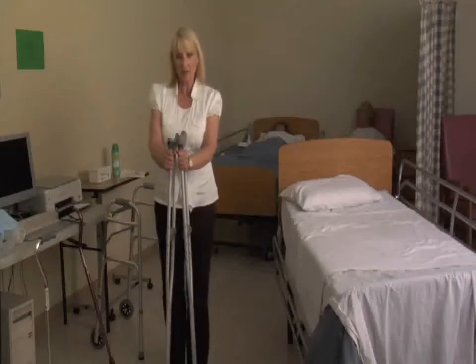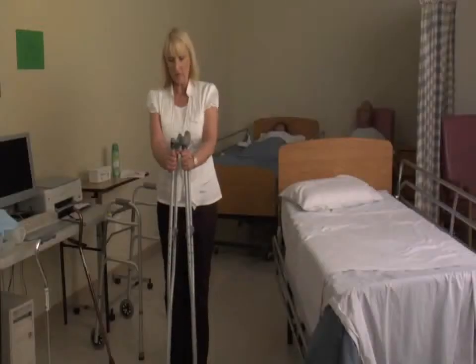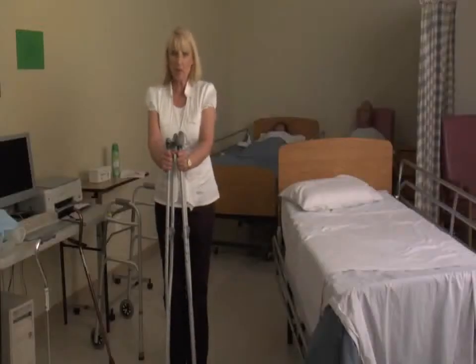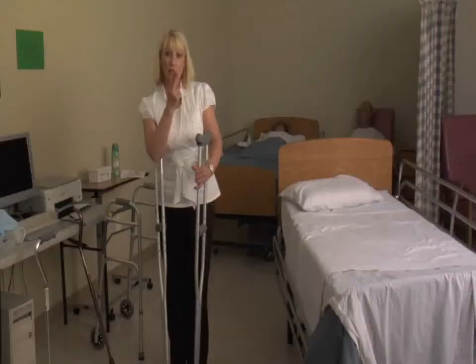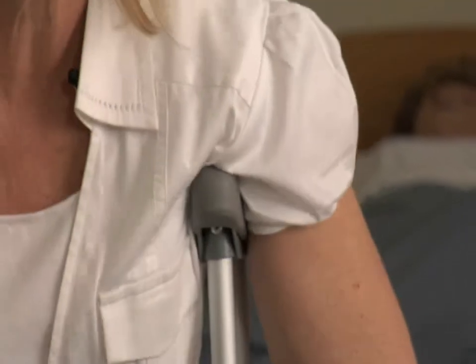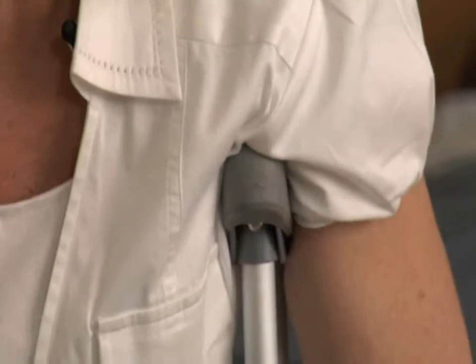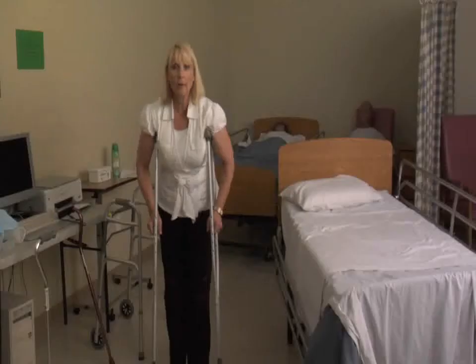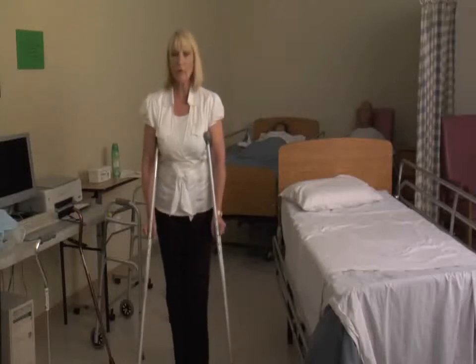Now I want to explain crutches. When a patient has been ordered to use crutches, initially they will be non-weight bearing, so they can't put any weight on their foot or leg. The crutches should be fit to the patient so that there's at least 2 finger breadths between the armpit and the crutch. We don't want patients leaning their armpit on the armrest because they can get permanent damage to the nerves under the arm. So their weight should always be on their hands. So the crutches go forward first, and then the patient will swing through.